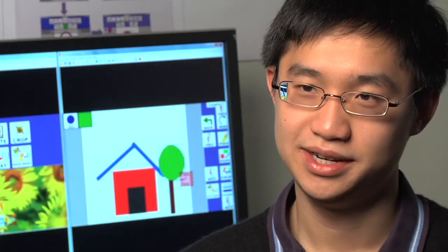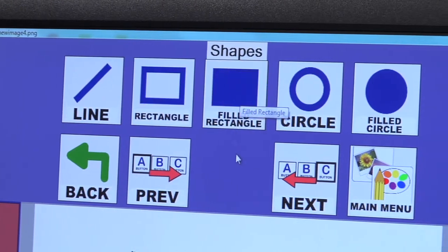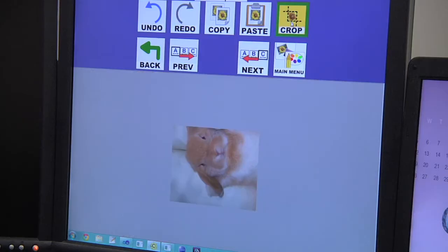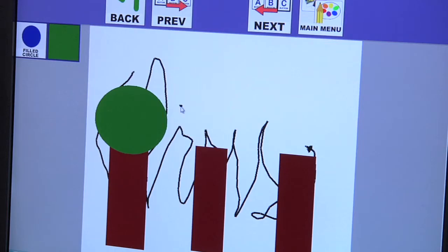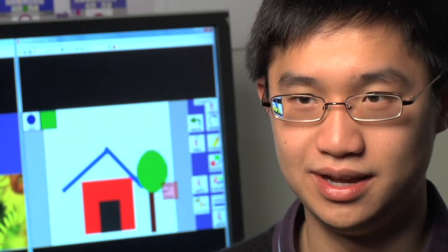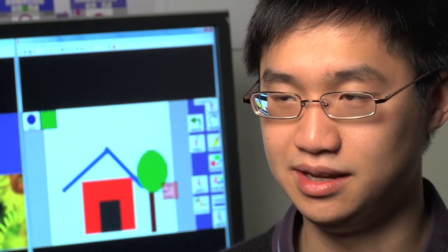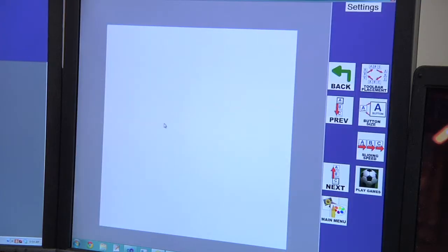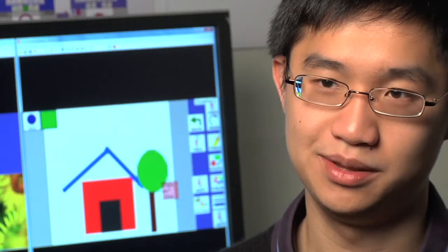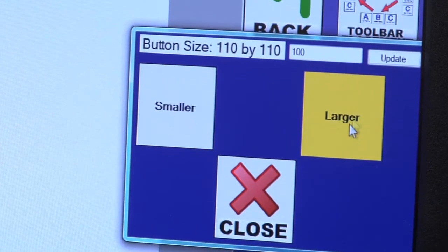My main project is Camera Canvas, designed to be used with the Camera Mouse to edit photos and make drawings. If they have better control in a horizontal axis versus a vertical axis, they can place the buttons horizontally. And they can also grow and shrink the buttons so they have bigger targets to click on.